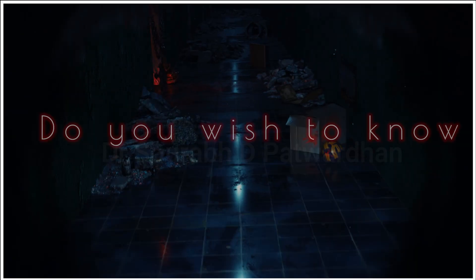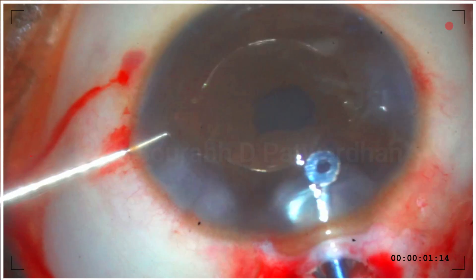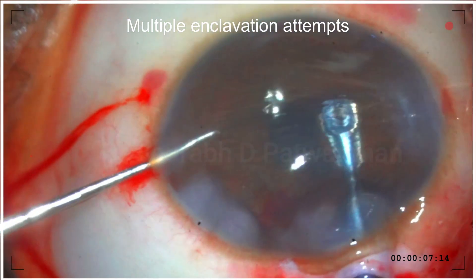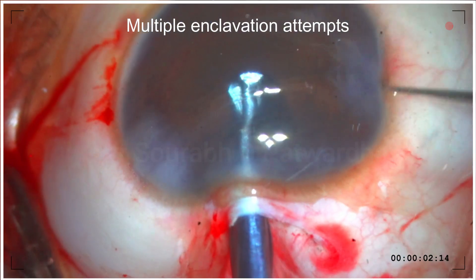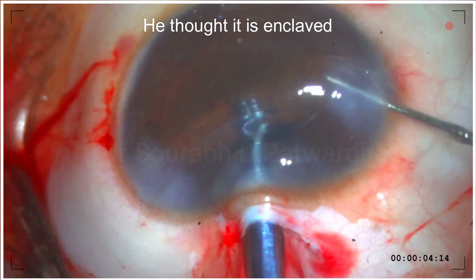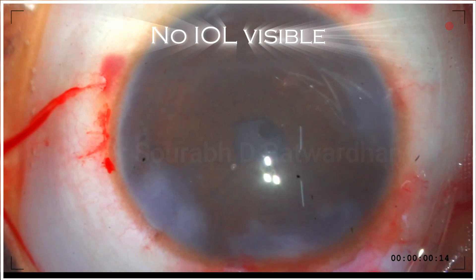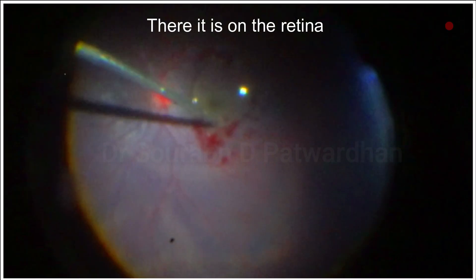Now, do you want to know what happened in that one hour before I was called back? Here is my colleague after I handed over the case — this was his first enclavation attempt, but he did it multiple times because he was having difficulty. He thought it was enclavated and tried to enclave the other side, but then the IOL was not visible — it had settled down on the retina, as you can see.